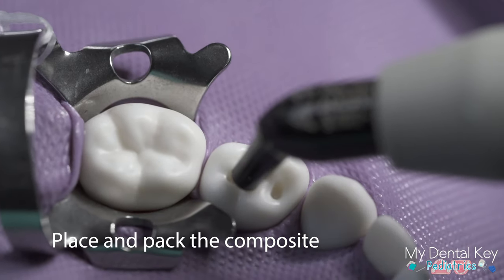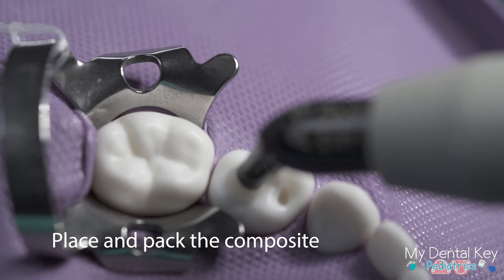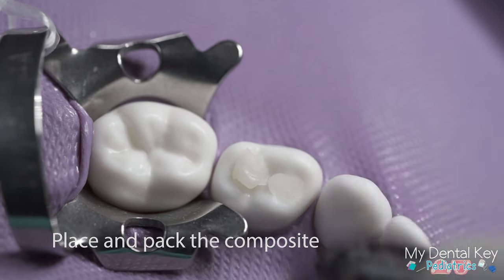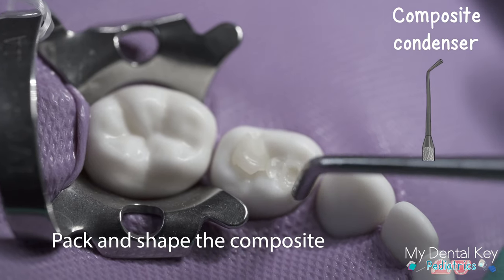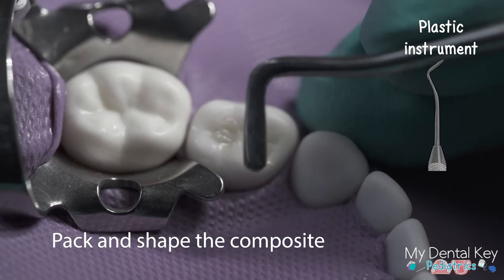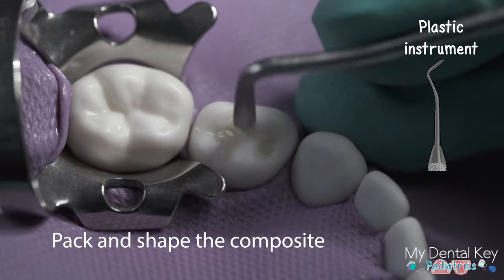Extrude the composite from the composite gun into the most pulpal portion of the preparation. Increments of composite should be no more than two millimeters thick. Use the smallest condenser to pack the composite and ensure that it is flush with the preparation walls. Continue to shape the composite using hand instruments, removing excess composite along the way.